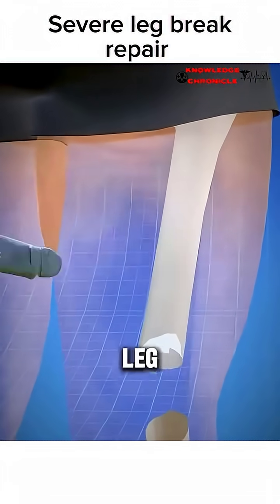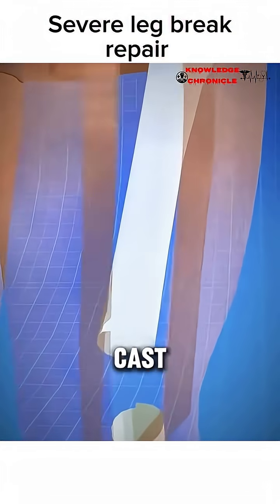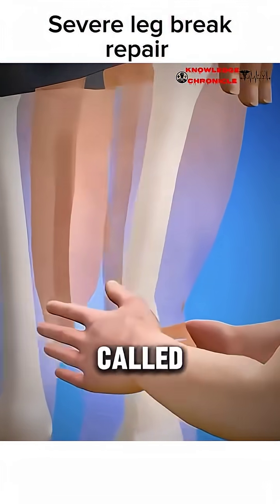Ever wondered how doctors fix a badly broken leg bone? Instead of just putting on a cast, they often use a procedure called internal fixation.